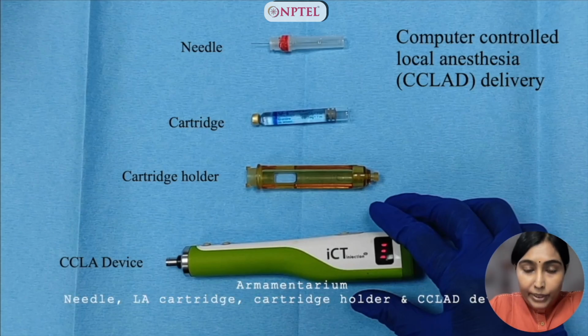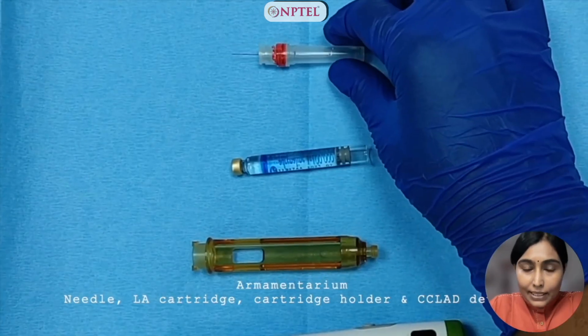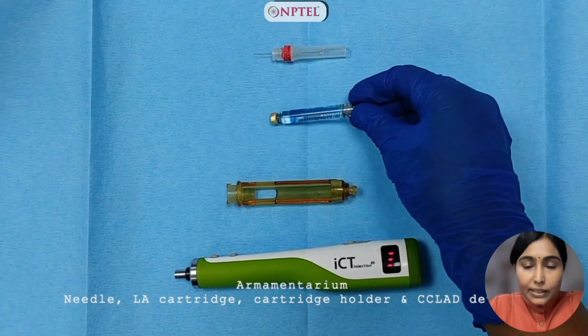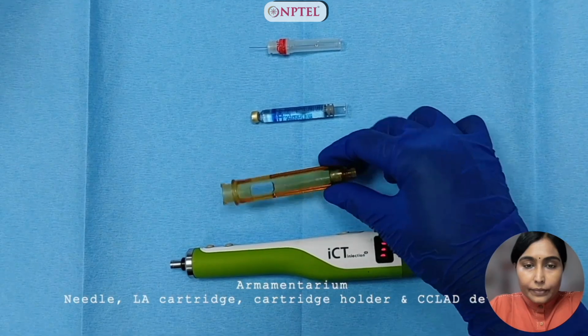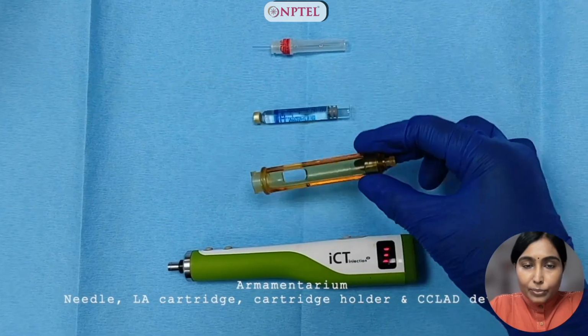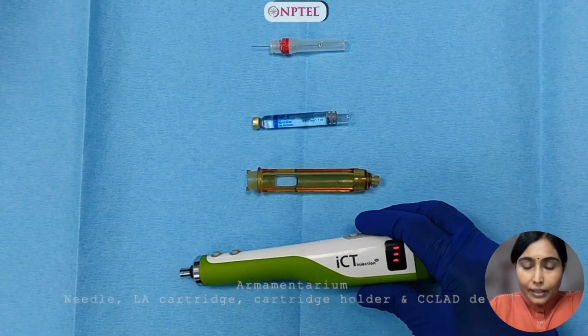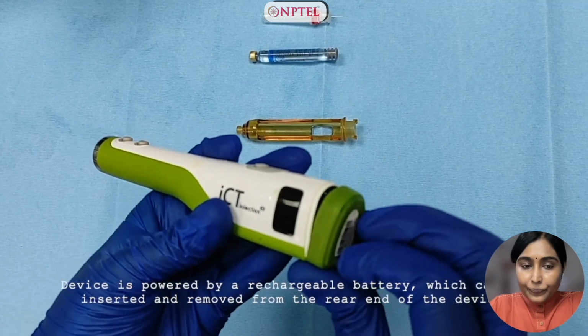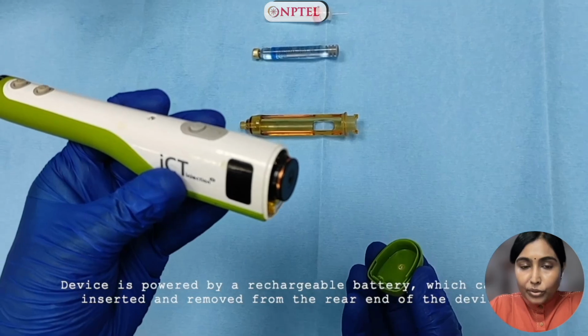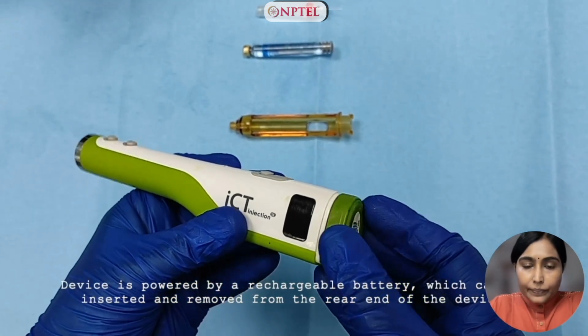So this is the armamentarium setup for the computer controlled local anesthetic delivery system. That's the needle and cartridge. These are what we generally use with the cartridge syringe system. This is the cartridge holder with two windows, small and large. And this is the C-CLAD device. The device is powered by a rechargeable battery which can be inserted and removed from the rear end of the device.